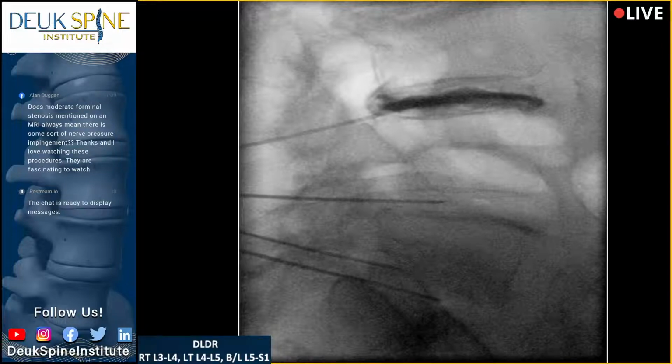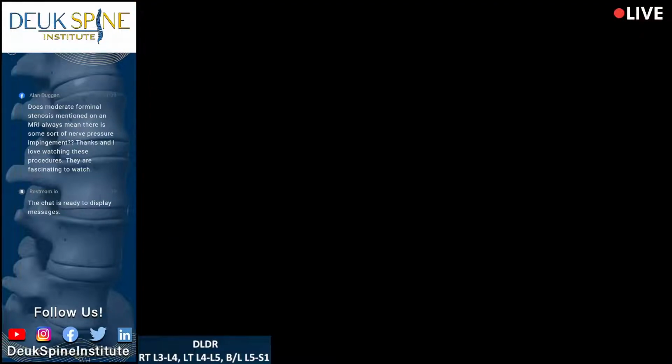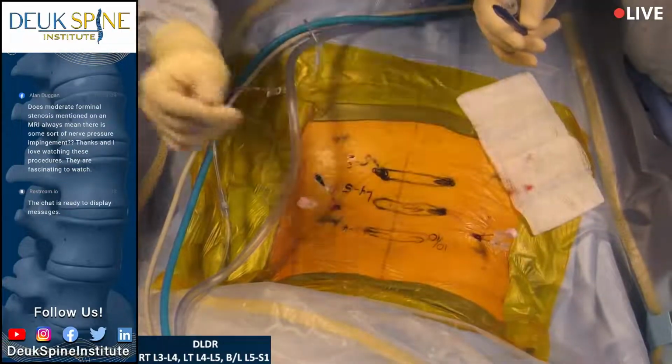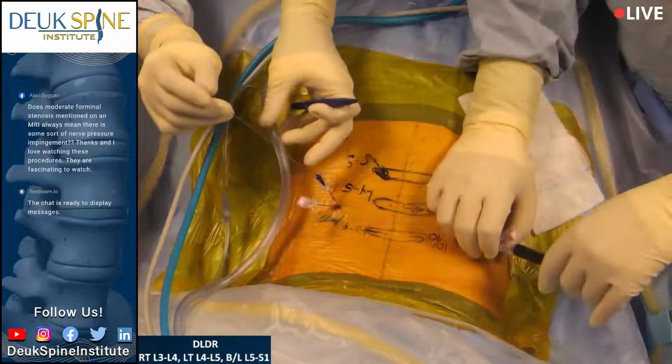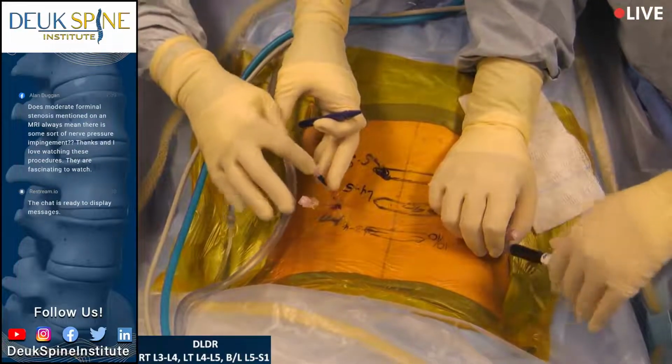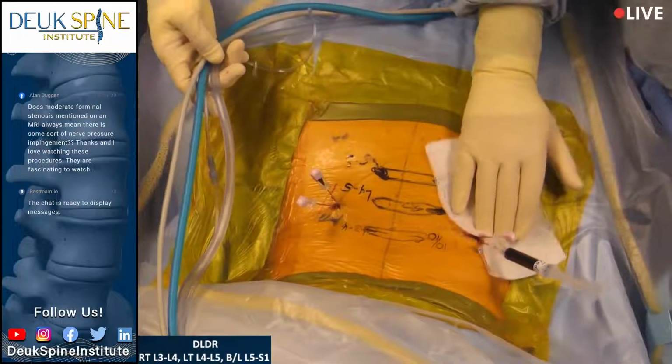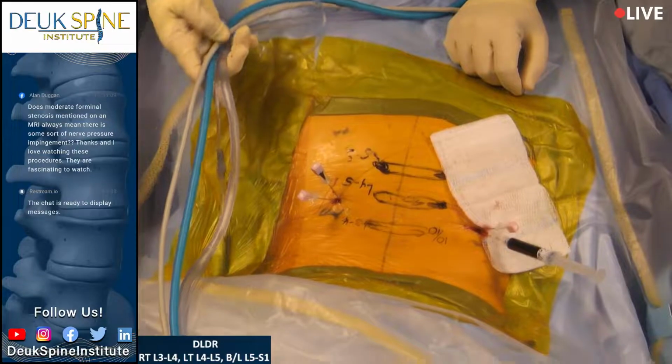So that's a 10 over 10 and C means concordant. Concordant pain means that's the typical pain she gets every day. I didn't just create it, I just elicited it. We should do the other one. I was going to put the stylet in, but. All right, so we know that L3-4 is a 10 out of 10 and it's concordant. It's the kind of pain she gets every day with her activities. That's the pain we're targeting, by the way. You all right? Better? Did it go away? Okay, you feeling all right?